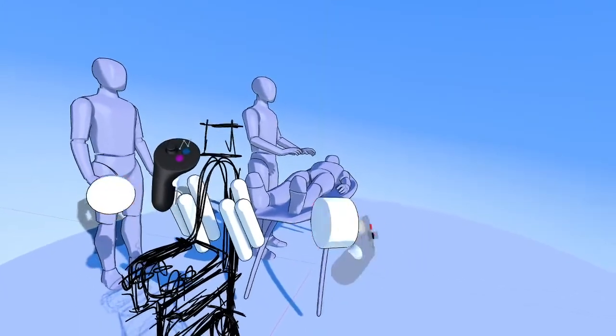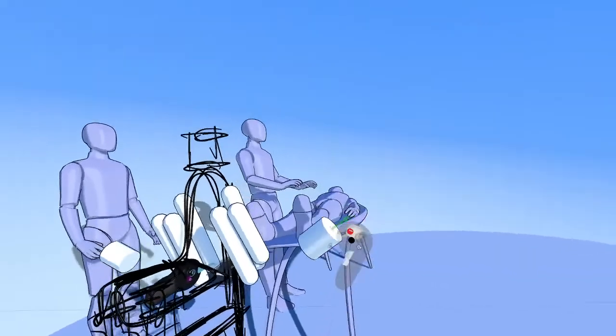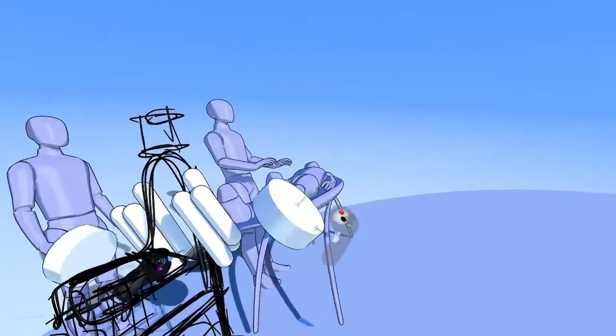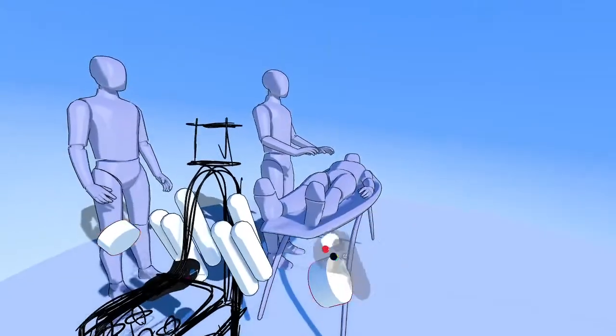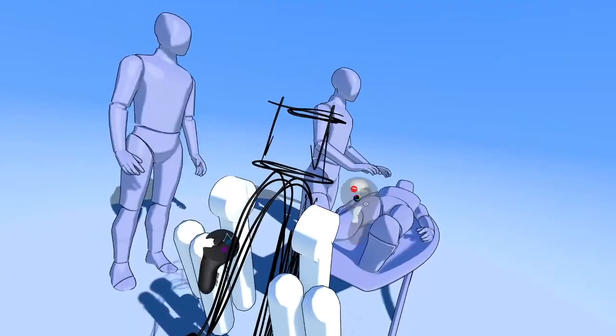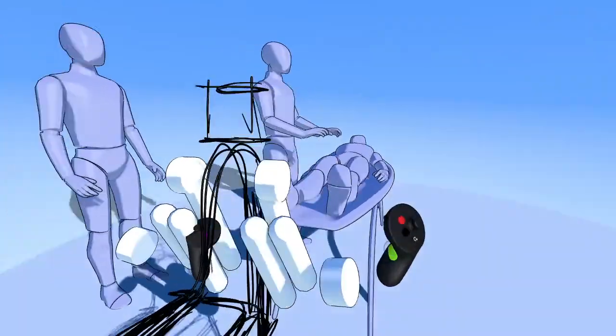And if you drop a primitive shape in and put it into edit mode, you get these very simple ways of adjusting the size and scale of it. So in this case for the cylinder, I just have two arrows, one for the radius, the other one for the depth of it. And that's all I want right now because we're just doing this very blocky thinking. So I'm going to place one there for the shoulder. I think that's probably a good place to have it.